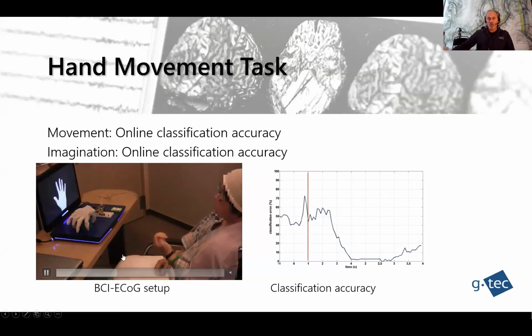So the next one will be a mistake. Watch careful. The instruction is peace. She makes a fist, and also the robotic hand makes a fist. Maybe I'll play it again. So the next one is the mistake. She makes a fist, the robotic hand makes the fist.